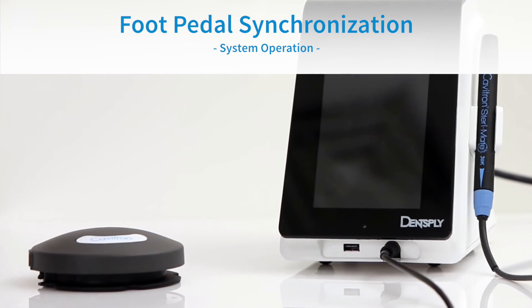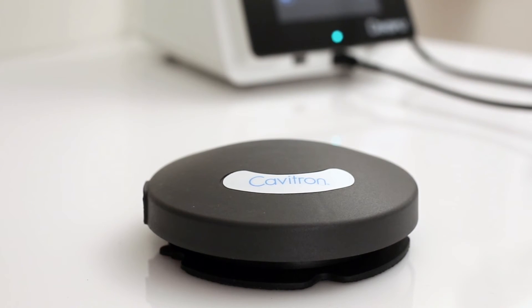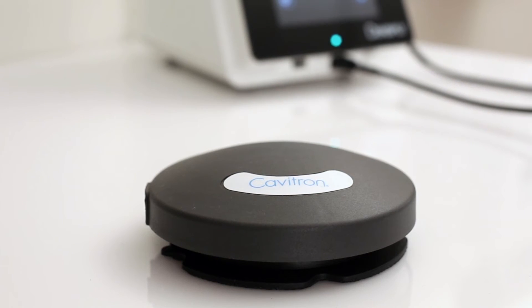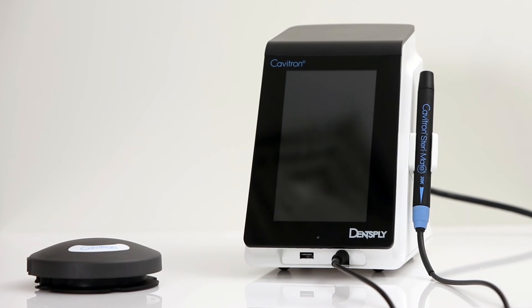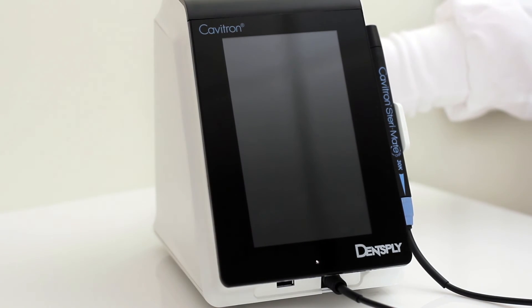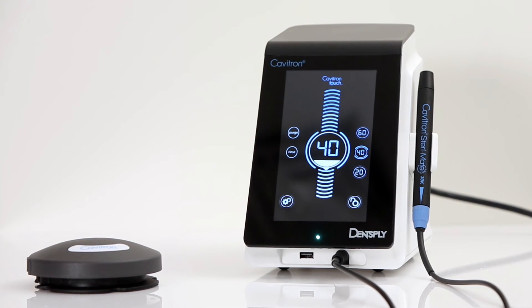Tap-on foot pedal synchronization. The tap-on wireless rechargeable foot pedal supplied with your system has been factory synchronized with the base unit. Should a replacement foot pedal be necessary, synchronization will be required prior to system operation. Users should maintain a distance of no more than 10 feet between the base unit and tap-on foot pedal during the synchronization process. To synchronize the foot pedal, begin by turning on the main power switch located at the rear of the system. The main screen will appear, also referred to as the scale screen. Please remove any inserts from the handpiece.